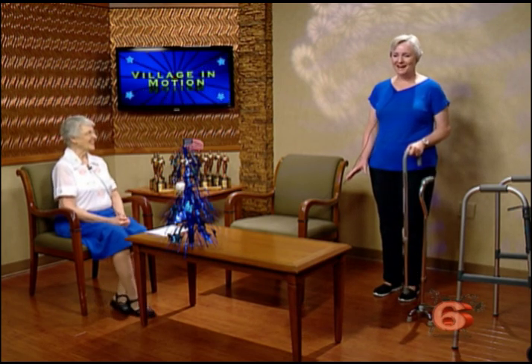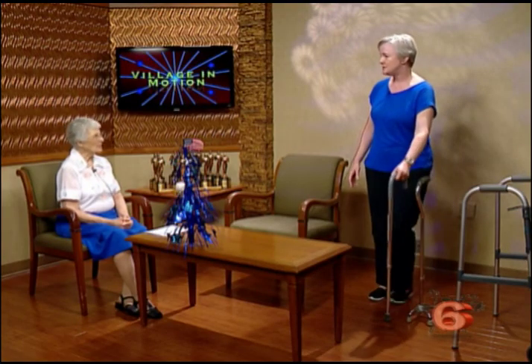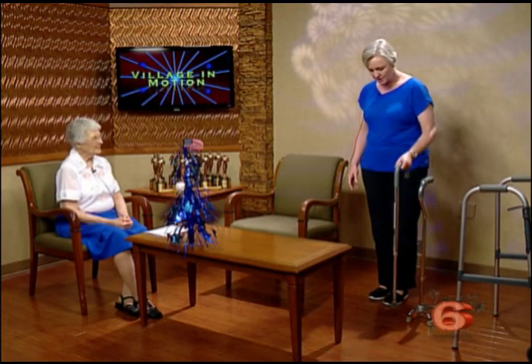And I see a lot of people who sometimes will carry the cane. Yes, I've seen that. Even if you just need a little bit of support, it's safer to actually keep it on the ground and use that support instead of carrying it, because if you were to start to lose your balance and it's up like this, you could quickly stumble. So it's very important, proper usage of assisted devices.